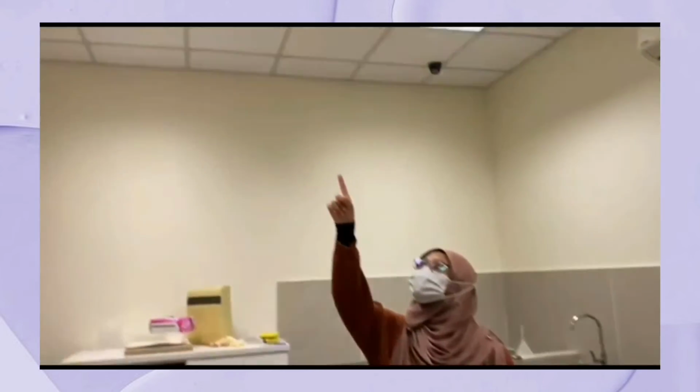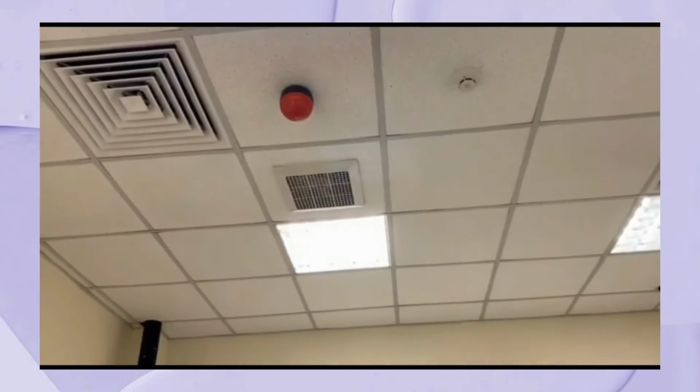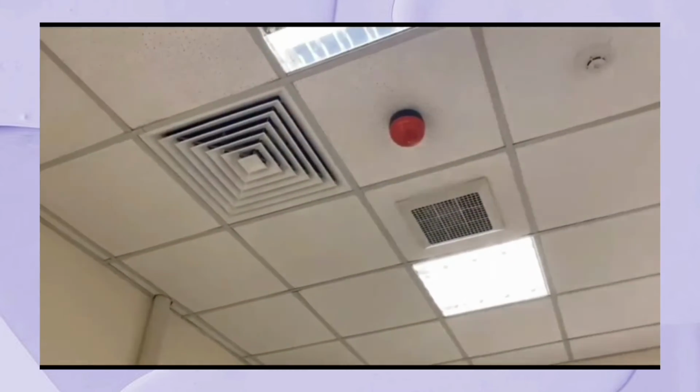Okay, so in here we have a darkroom safe light. Okay, so we will turn off the light. So the safe light will turn on, and it can help us to see when we want to process the film.